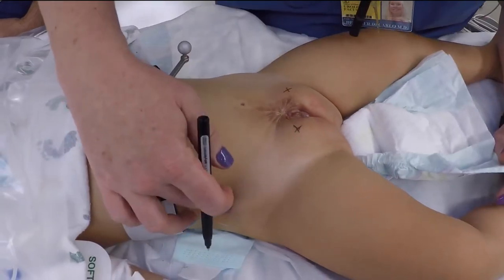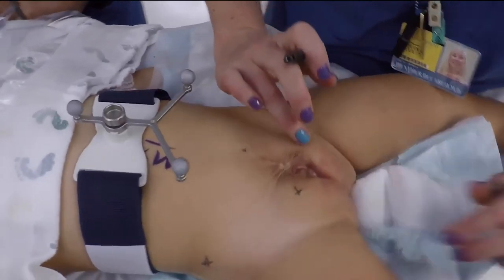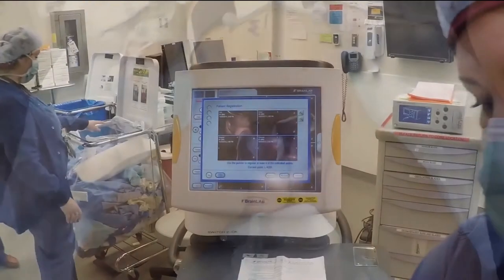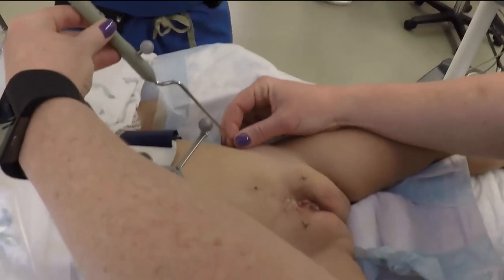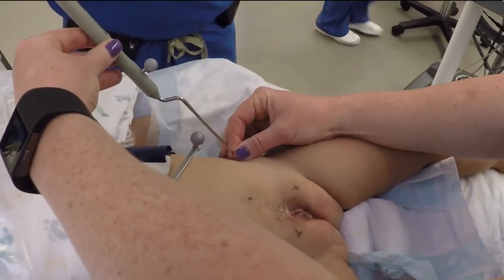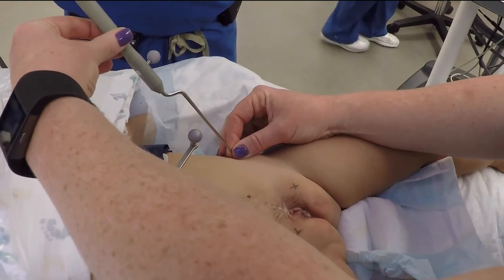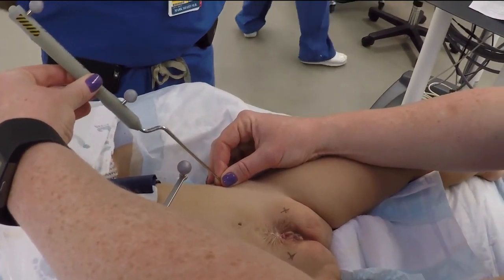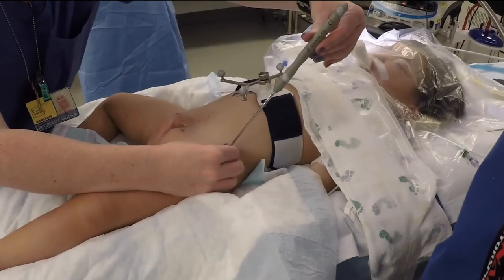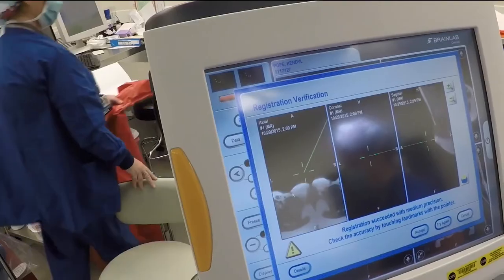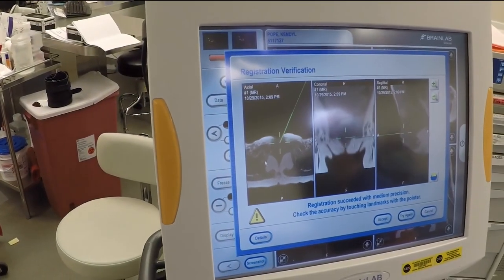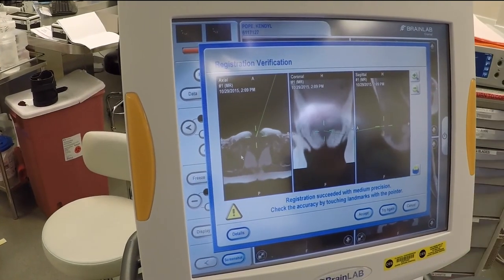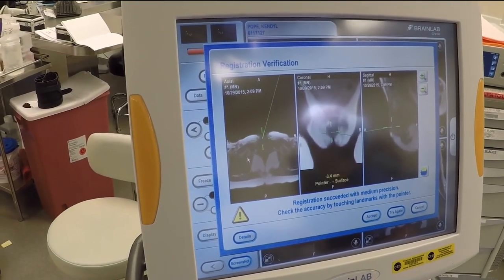Intraoperative registration is performed after preoperative planning with a pediatric radiologist and pediatric urologist utilizing bony anatomic landmarks. A reference array is attached to the patient via a head strap, and the bony anatomic landmarks are pointed out using a stylet. This correlates to the MRI which is loaded on the BrainLab system.